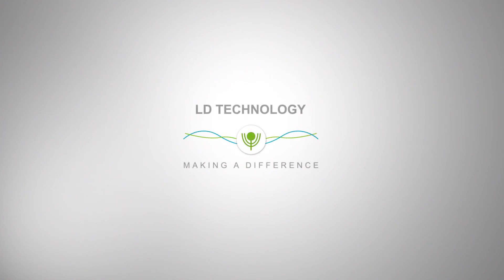LD Technology is proud to introduce its new wireless TM-Flow system. This video helps you to set up the TM-Flow hardware.